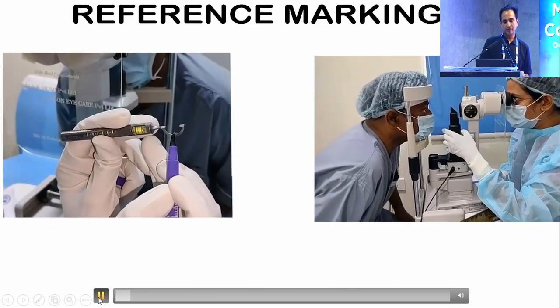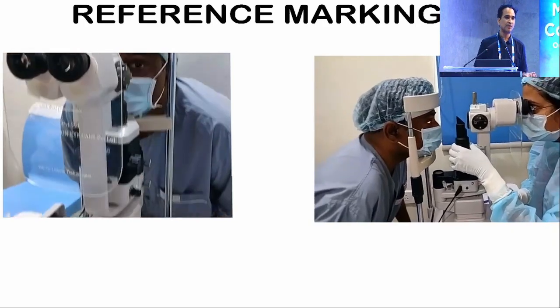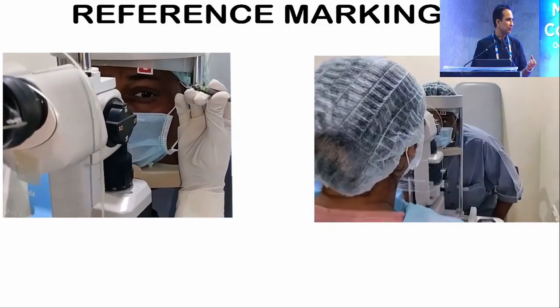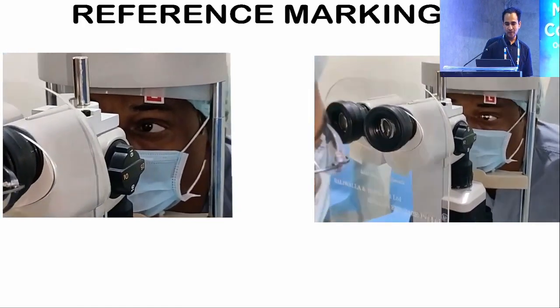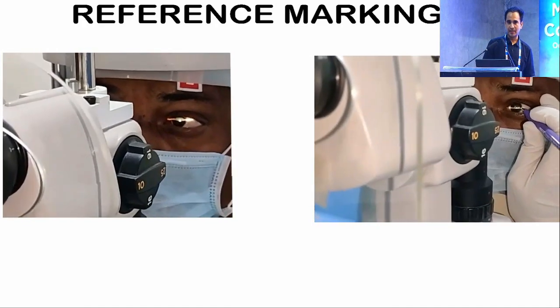So even if you go for a digital imaging system, we always tend to mark the patient, because you never know. Sometimes that digital imaging might not register. And suppose you block the patient, it will be even more difficult. So at least take a reference marking, either with the bubble marker or direct freehand marking.